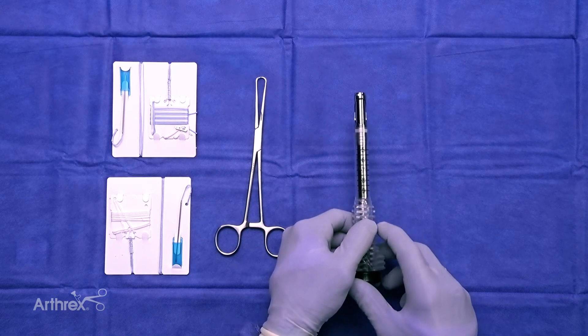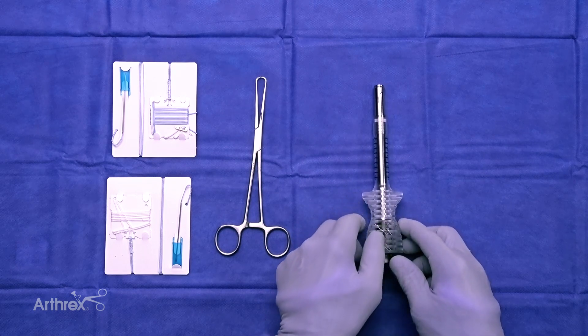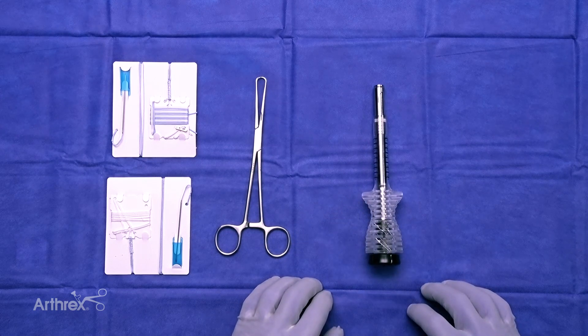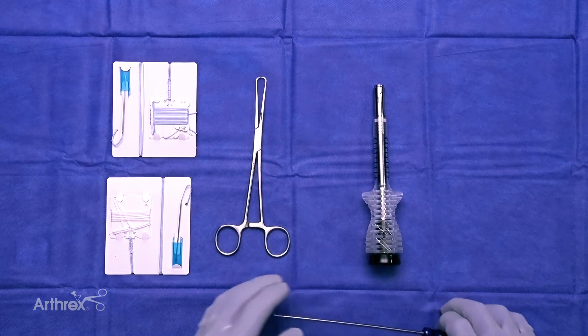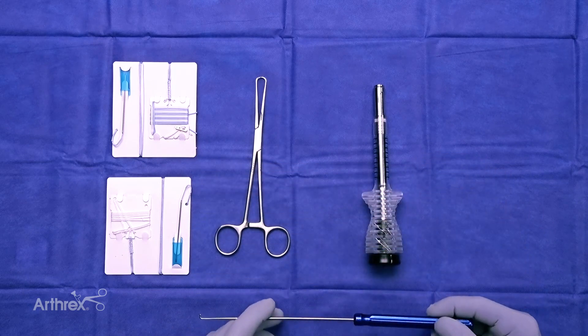Once we have our graft, we are going to prepare it with fiber tag tightropes on both the bone patella side and the quad tendon harvest side. The fiber tag tightrope has become very utilitarian for all knee surgery.